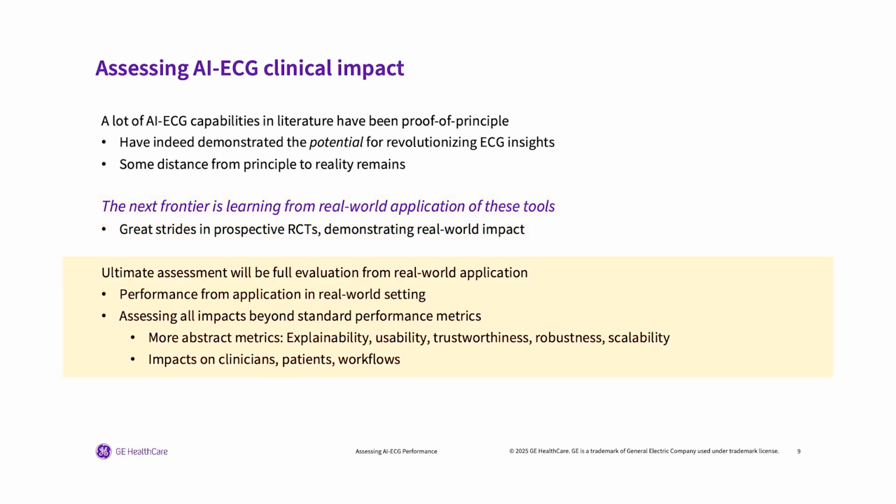So the ultimate assessment is the full evaluation from the real-world application, and that includes assessing these performance metrics on the true evaluation in the real world, but also assessing all impacts beyond these standard performance metrics. And in this context, we can think of explainability, usability, trustworthiness, robustness, scalability as almost like separate metrics that we should not forget about. And of course, the impact that they would have on clinicians, patients, and ultimately that determines how easy and successful these tools can be in integrating in existing workflows or developing entirely new workflows around them.